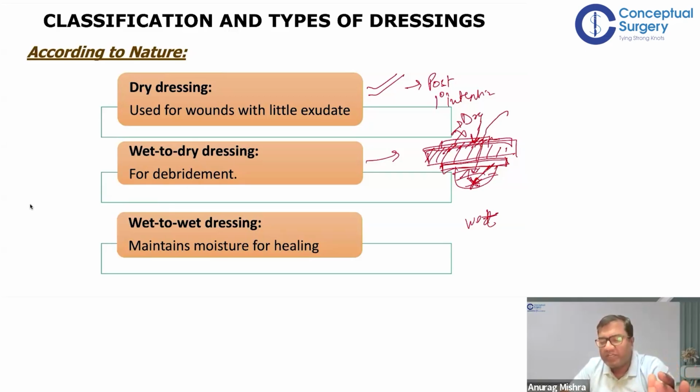And that is why we always say, as soon as this gets soaked, you have to remove the dressing and change the dressing. And if you suspect that the wound is producing a lot of secretions, then have a good amount of padding so that the outside surface remains dry. These are some tricks which, if you apply, will look good also. Just imagine, nobody likes a dressing which is soaked with pus or blood. So that has to be kept in mind.